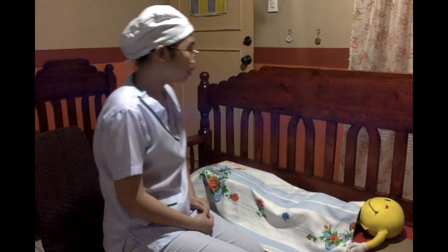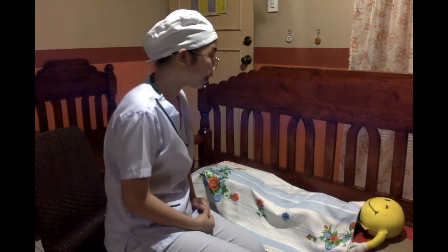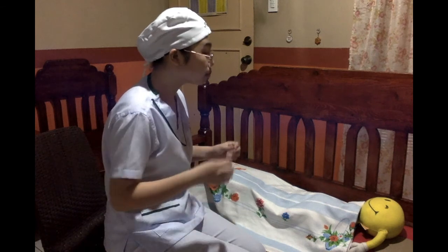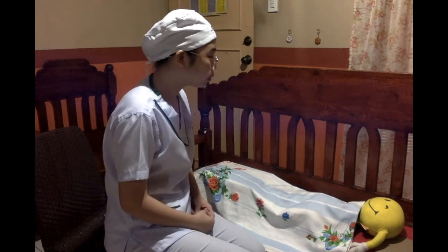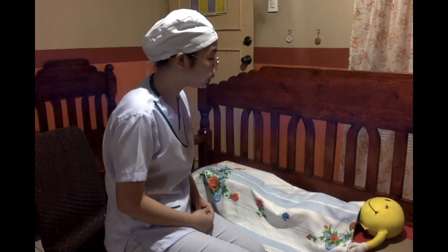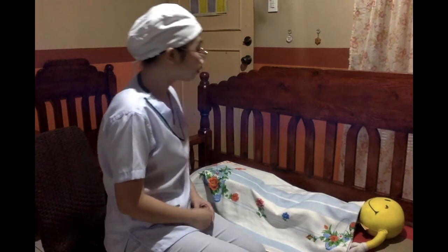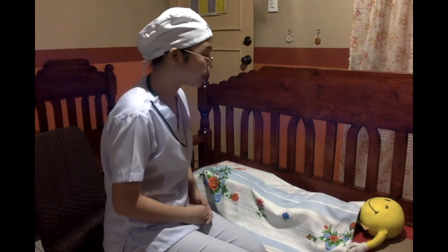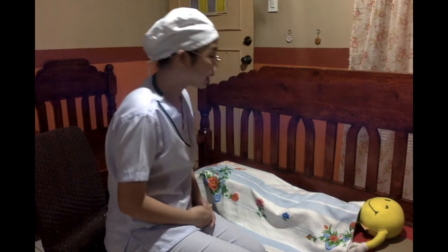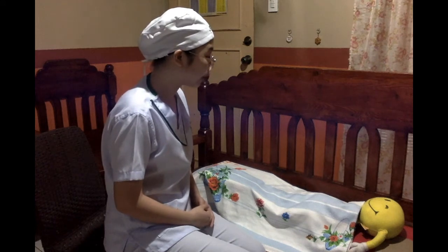Hindi pa po. So, yung catheter po kasi o yung pagka-catheter, bale, may ipapasok po ako na manipis po na tubo doon po sa parte po ng puwerta ninyo na tinatawag pong urethra or yung urethral meatus. So, yung butas po kasi na yun, doon po lumalabas yung ihi nyo po. Po ay kagaya nga po ng sinabi ninyo, hindi po kayo nakakaihi.